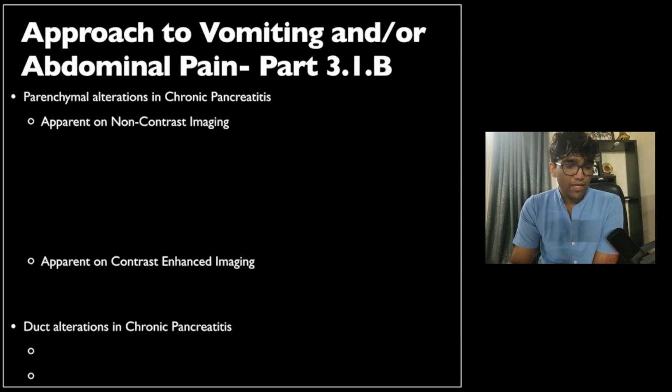So we'll be covering the topics under the following headings. We'll talk about parenchymal alterations in chronic pancreatitis, which are apparent on non-contrast imaging, and then what is apparent on contrast enhanced imaging. Then we'll talk about duct alterations in chronic pancreatitis.